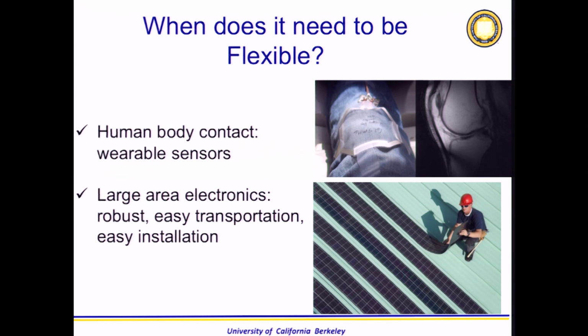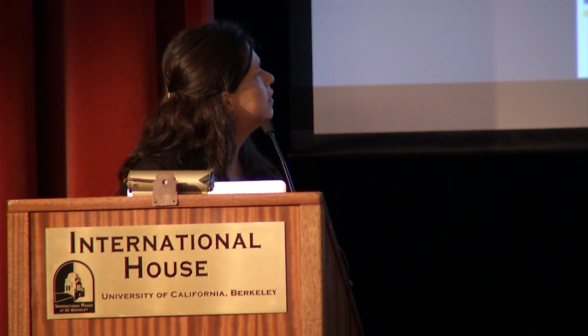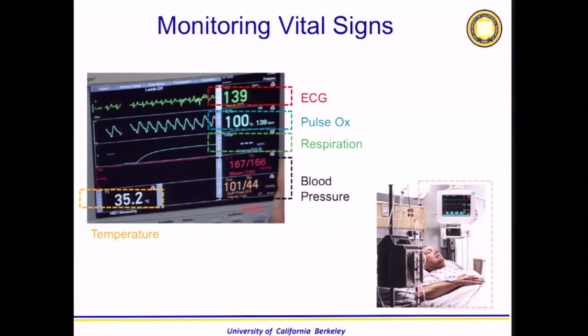So what are we doing in my group? We started off by saying, okay, one thing that everybody wants to do is to monitor health signs. When you go to the hospital, the first thing that they connect to you is a little blood oximeter that's going to measure your oxygenation. It's on your finger. It has LEDs and one photodiode, and then it's connected to a bunch of machines that are measuring and processing that data, extracting the data, and processing it in a way that it can be meaningful information about you.